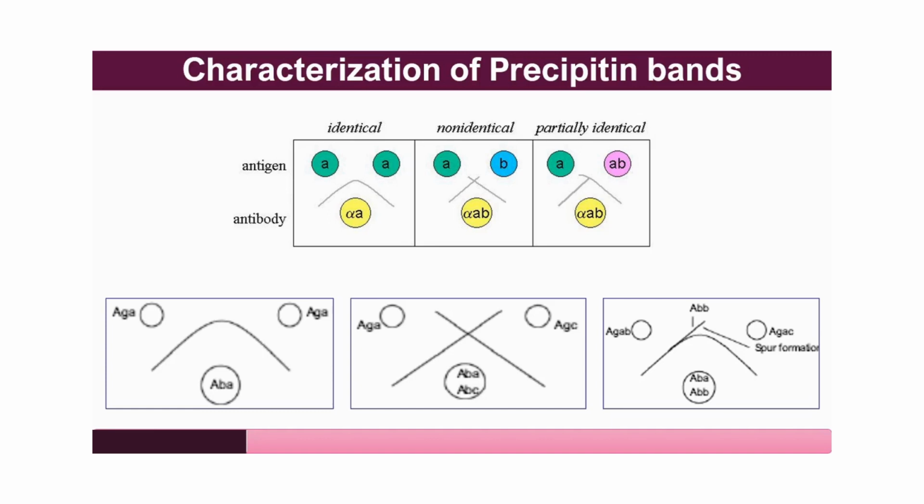Because of that, the diffusion, and if the concentration of these two antigens are also the same, not only the epitopes, their concentration is also the same, they will produce the precipitin band right in the middle between the two wells. Now here in this diagram, you can make out the precipitin band between antigen well and the antibody well is almost in the middle.